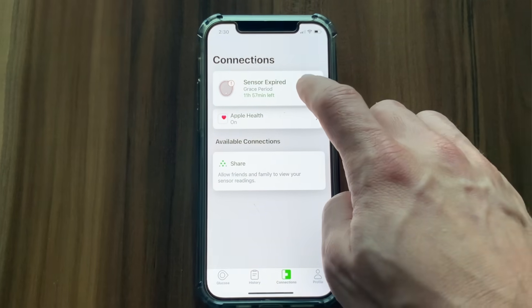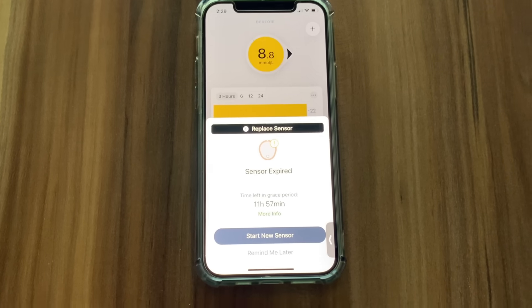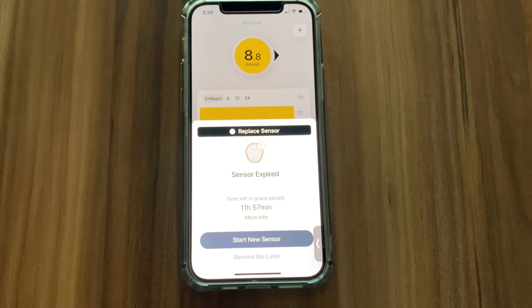Dexcom G7 gives you a special bonus called a grace period. After you've used your G7 for 10 days, you can keep using it for another 12 hours before it really stops providing readings. So if your G7 expires in the middle of the night or in the middle of an exciting date, you don't need to do the site change right away — you still have 12 hours to rest or enjoy your time, and do the site change in the morning.